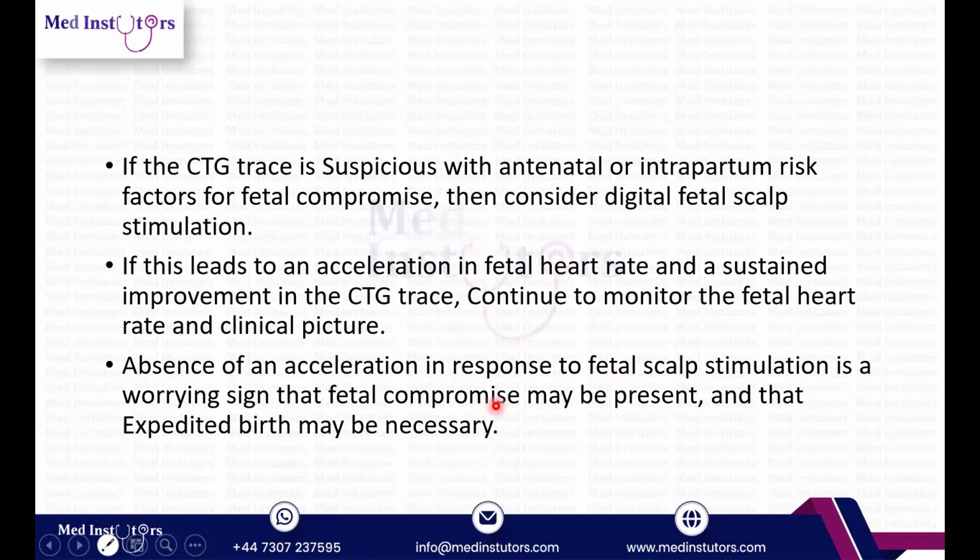Another line that they've said is that fetal blood sampling is something that they've not commented upon in this guideline. They've just commented about fetal scalp stimulation. And this guideline is only to be used for understanding intrapartum CTGs. Correct? That is, in labor CTGs. This was basically the end of my presentation today.